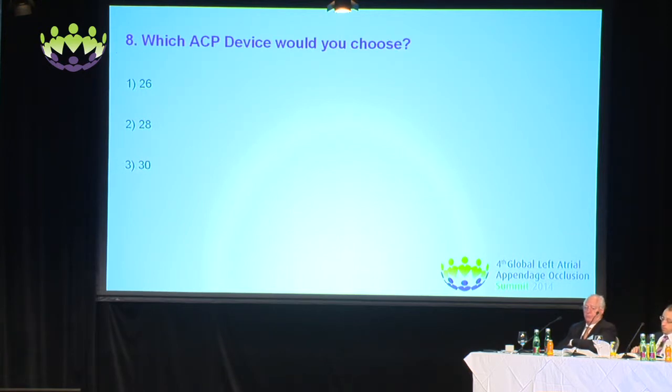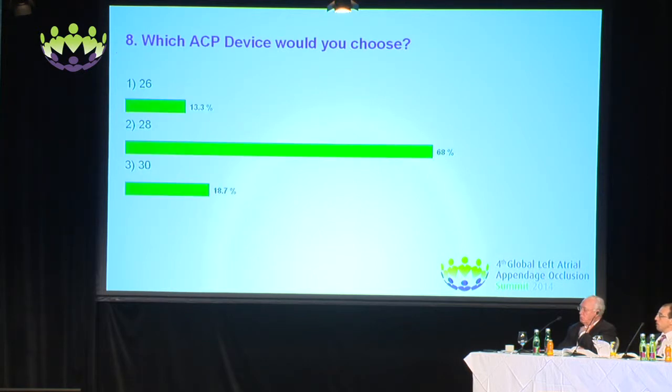On the basis of the evaluation of the measurements that ranged from 22 with the ICE minimum to 25 with the CT scan maximum measurement. This difference in measurement is frequent because the different measurement techniques usually give different results. We have the result, 28.